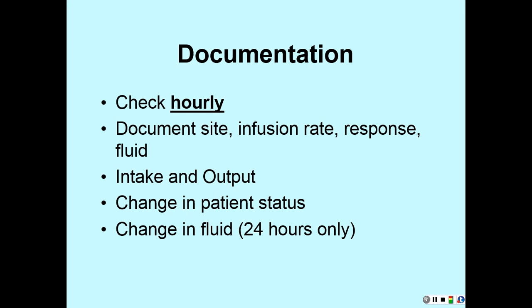We want to document the site, the infusion rate, what fluid is infusing, and how is your patient doing? What does the site look like? You're looking for redness. You're looking for swelling. You're looking for leaking.